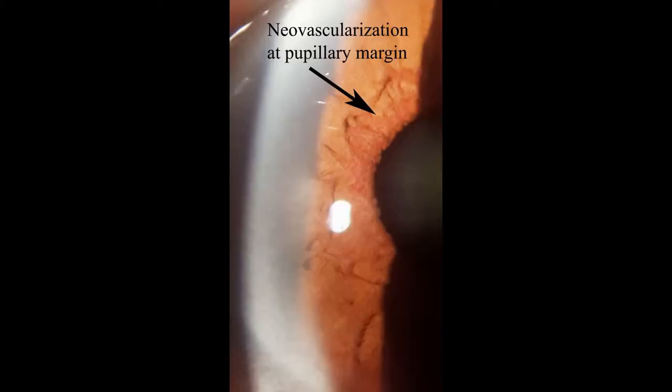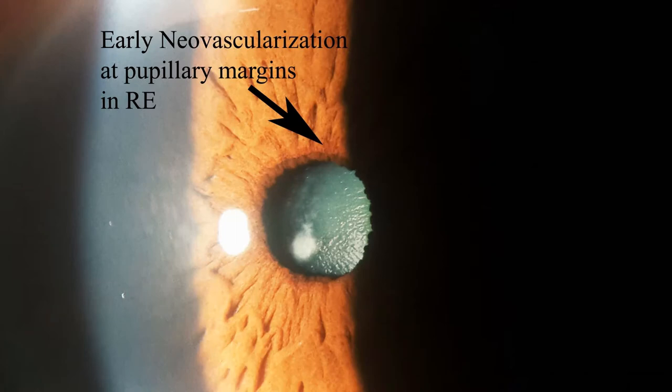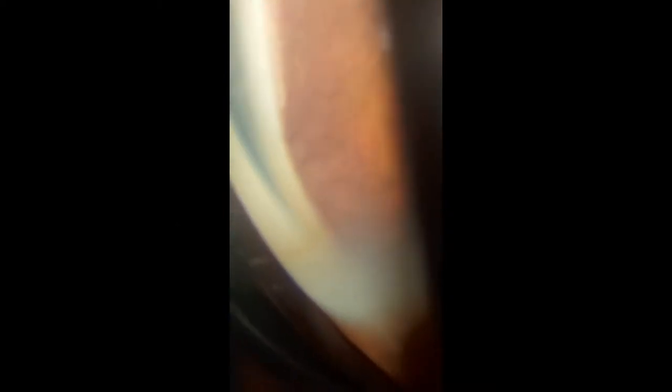Here is a patient with persistent hyaloid artery. In this gonioscopy video, the ciliary processes are clearly made out through the dialysis in a patient with angle recession and iridodialysis following blunt trauma. This is a patient with neovascular glaucoma; neovascularization of the pupillary margin is evident in this photograph. Gonioscopy video shows open angle with new vessel in the angle and couple of goniosynechiae.